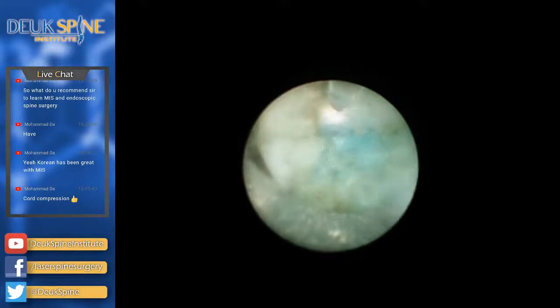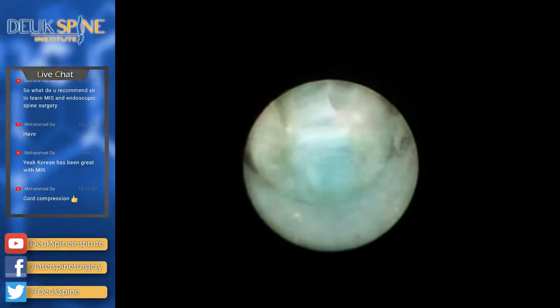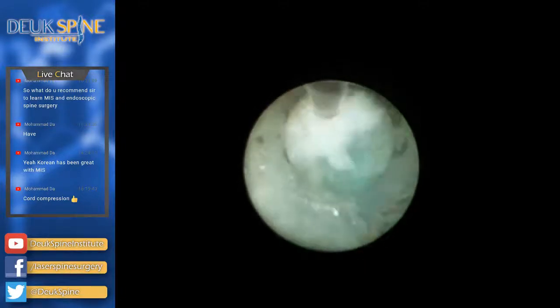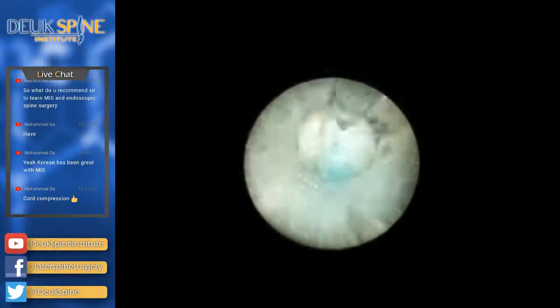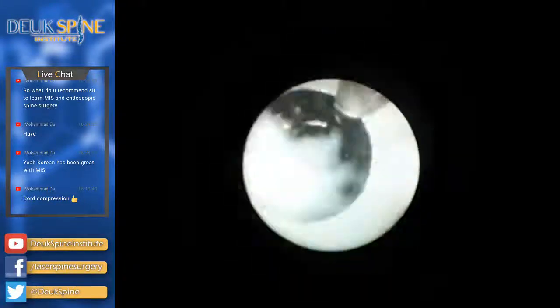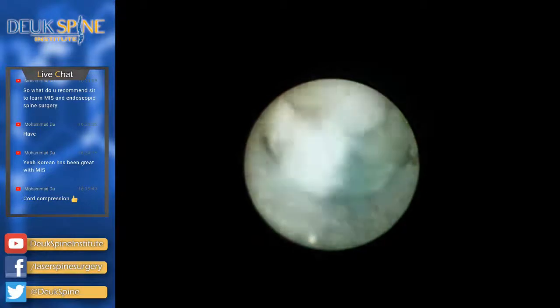If you watch my last surgery, you know what I'm talking about. Here we are in the middle of the spine, and we saw a big herniation come out of there. That was sitting right on his spinal cord. And here's another one. Wow. Well, it's unfortunate. This thing did burst through his posterior ligament in the middle of the disc, basically. And now it's sitting on top of the spinal cord. So there's another piece coming out. This is all that giant herniation he has on his MRI. The good news is we're getting it, but the bad news is I had to go through the posterior ligament to get it.